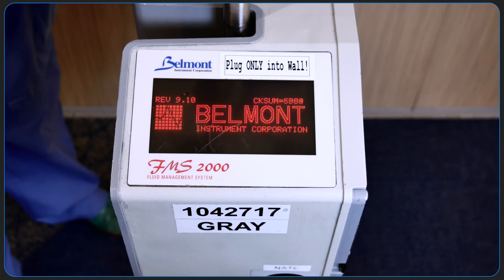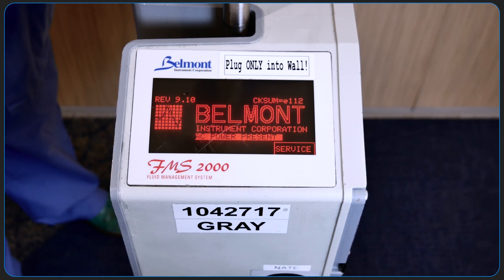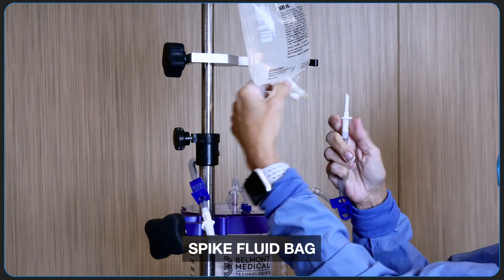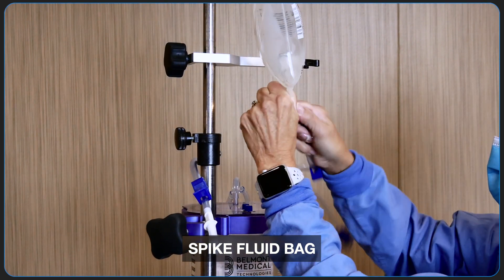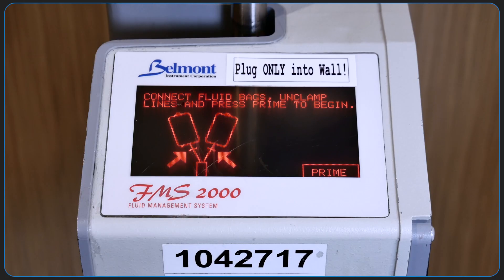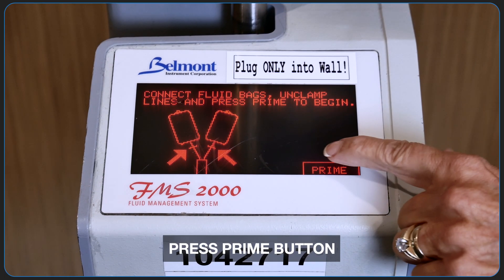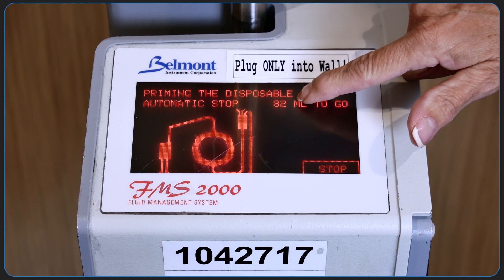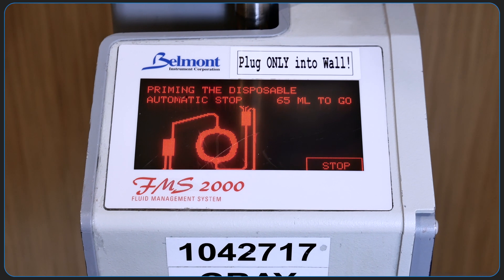As the Belmont is powered on, you'll notice the words 'AC power present' if the Belmont is plugged into AC power, and then the prime screen will appear. To prime the circuit, a fluid bag is spiked and a clamp is opened to fill the reservoir. Select the prime button and 100cc of fluid will then be recirculated through the set to remove any air and replace the internal circuitry with fluid.